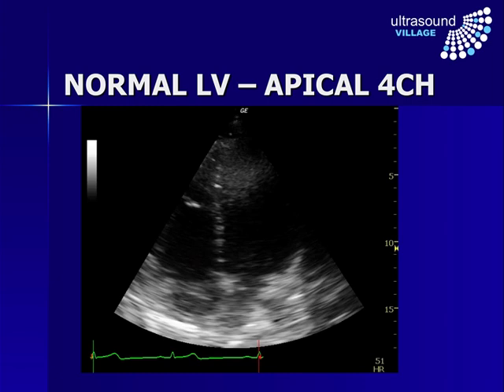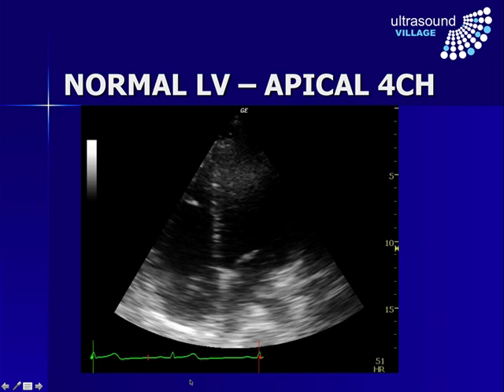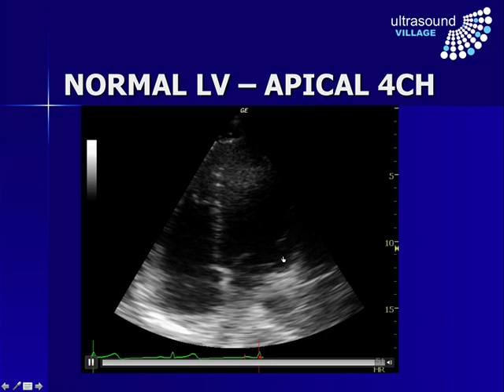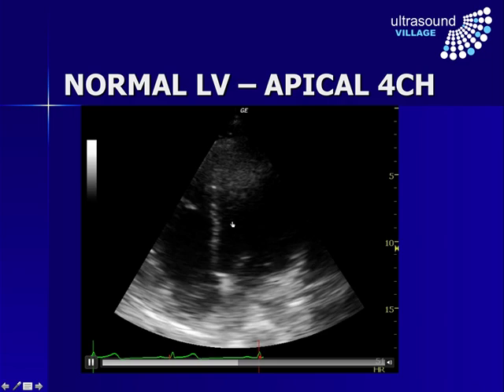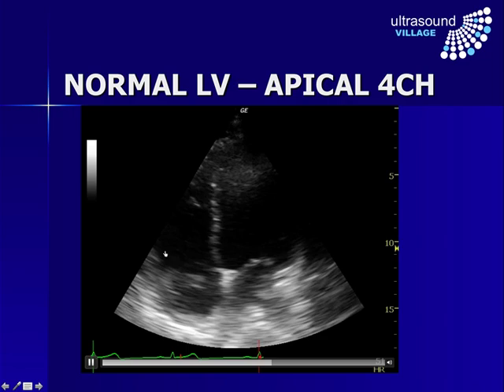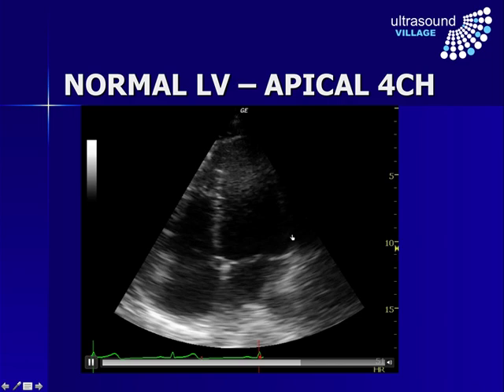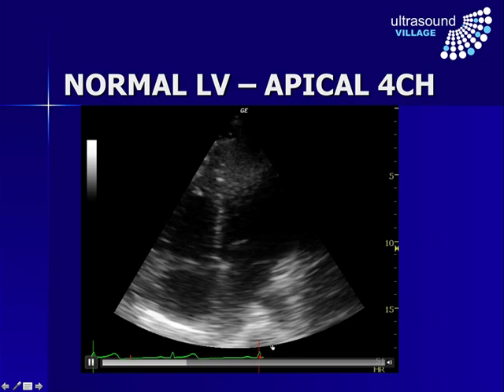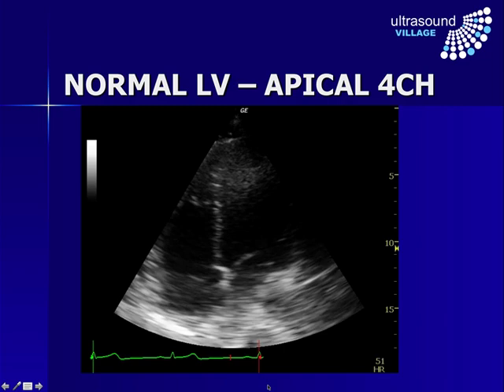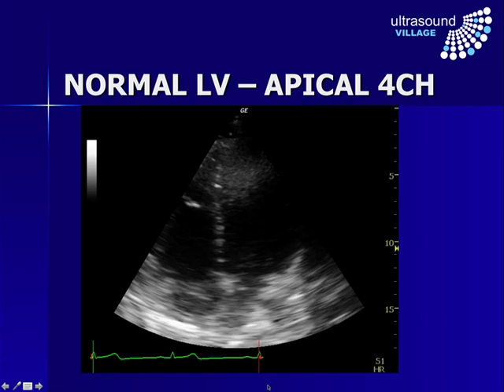Here we have the apical four-chamber view: left ventricle, right ventricle, right atrium, left atrium with the aortic outflow tract. This is the same patient as we've just seen in the previous loop. As I mentioned, there doesn't actually appear to be quite the same level of cavity size reduction in this view. But this is not actually the case — in this view we're not really picking up the thickening of the septum that we did see in the other view, and we're not really seeing a great image of the lateral wall and its thickening. I don't place quite as much emphasis on the apical view, because if I'm not seeing those edges very well, I may not be properly estimating the cavity size reduction.